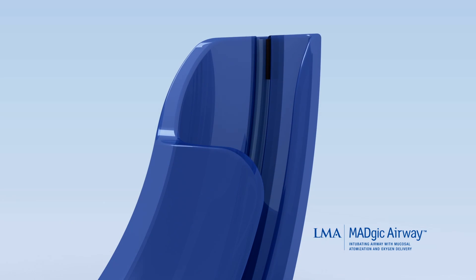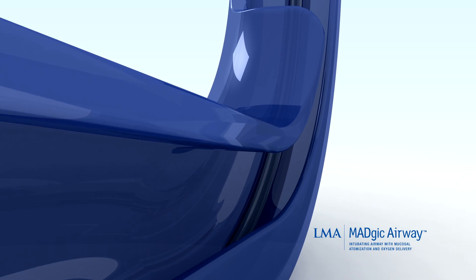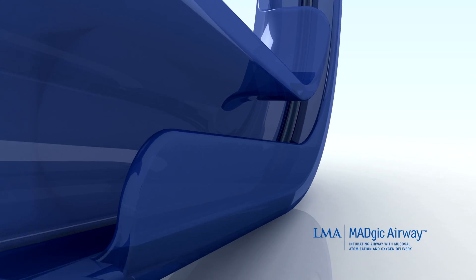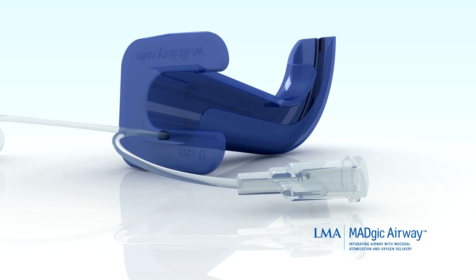The LMA Magic Airway combines atomized topical anesthetic and oxygen delivery in an innovative and elegantly designed fiber-optic oral airway to facilitate fiber-optic intubation.